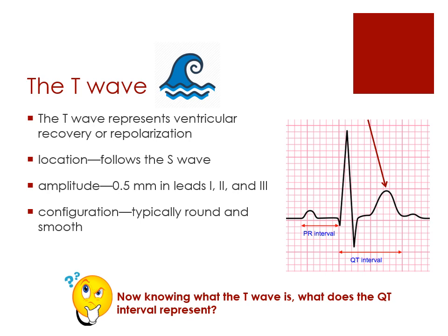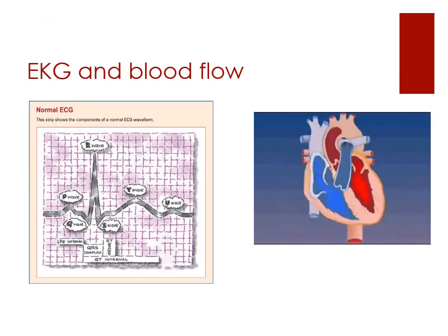So you have the P, the QRS complex, and then you have that T wave. And so remember, that's when everything relaxes and everything's getting ready to pump again. So right after that T wave, you will see the P wave in the regular heartbeat that you see. So again, when you have the P, Q, R, S and T wave, notice on here that you will have that. Don't worry about the U wave.